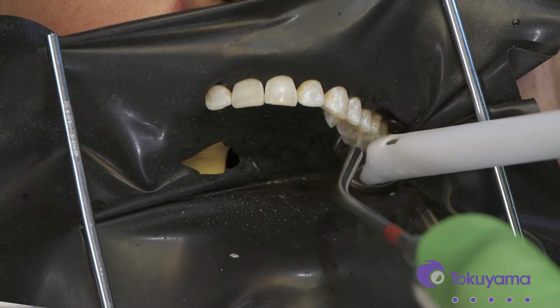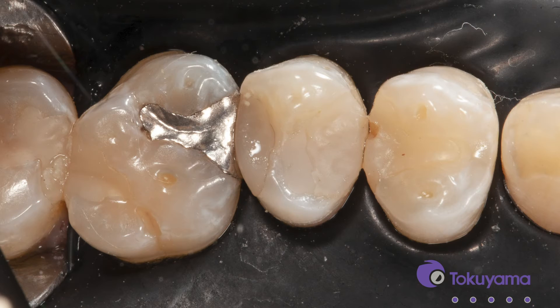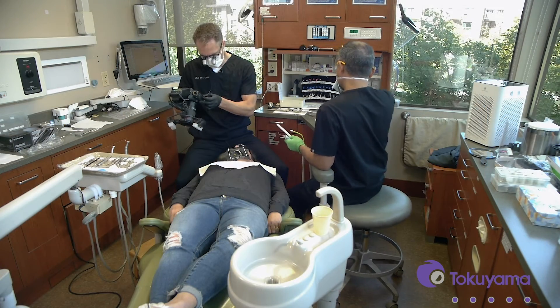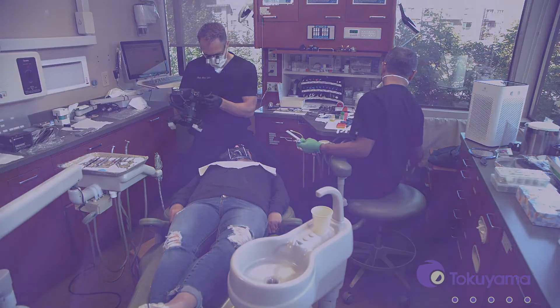All right, we got that old filling out. There's not a ton of darkening but there is a tiny bit down on that mesial box.